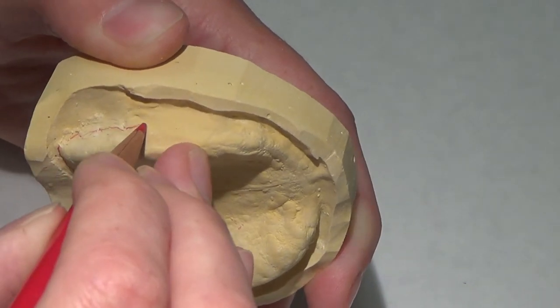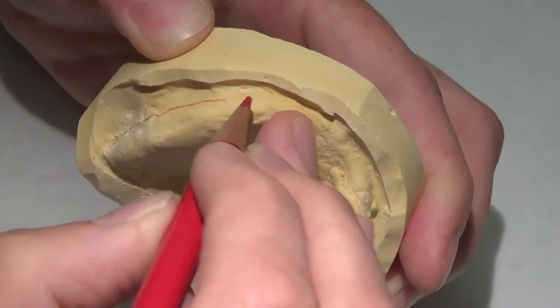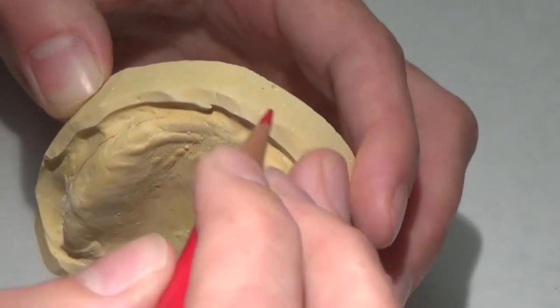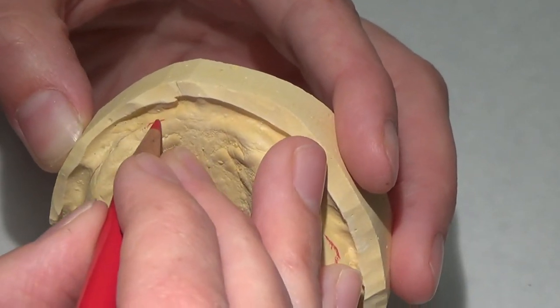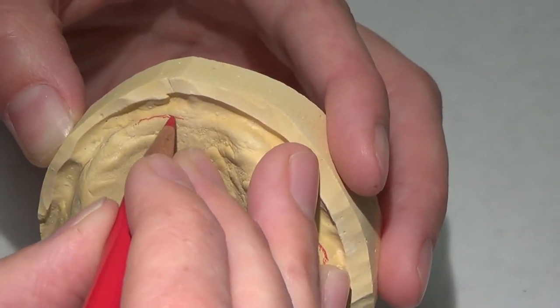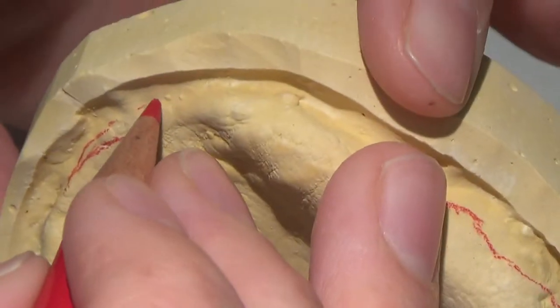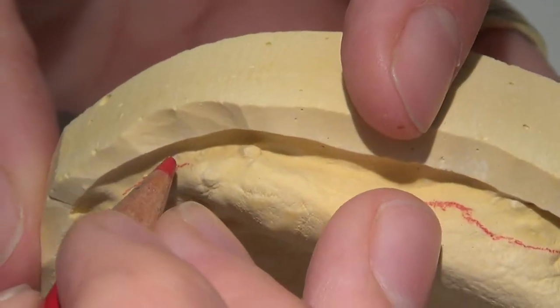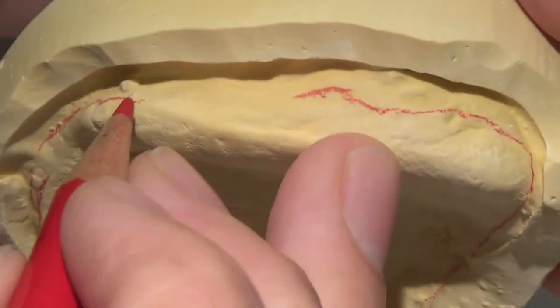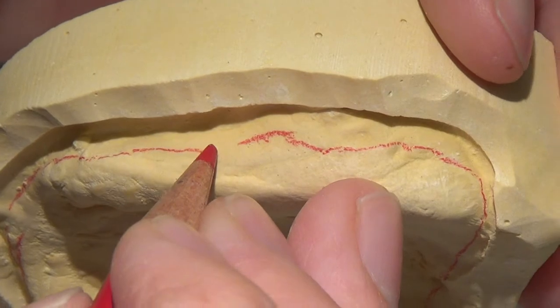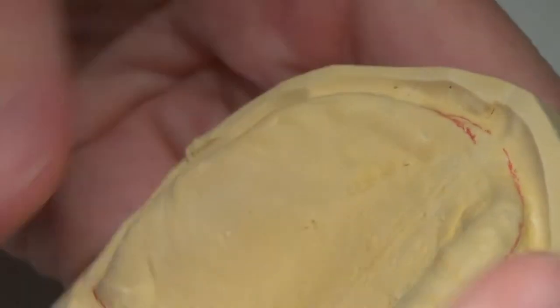She's got a frenum there. It's hard to see. Come up and around. And up here in the front, it's going to be hard. I'm going to just take it over the ridge but not down to the depth. It can't really be four millimeters shy of a zero-millimeter vestibule.